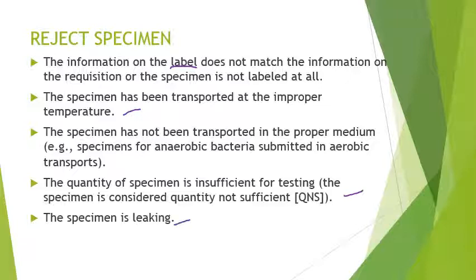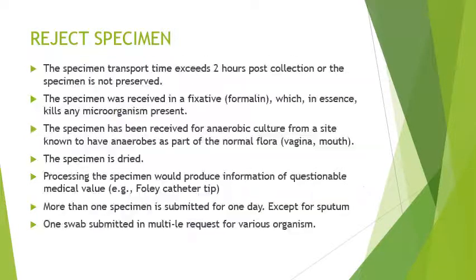Pero kapag CSF, okay lang kasi mahirap naman talagang kolektahin yung CSF. Ang hirap mag-lumbar tap ulit. Masakit. Next, if the specimen transfer time exceeds 2 hours post-collection or the specimen is not preserved. So, kung hindi siya na-preserve, then reject.